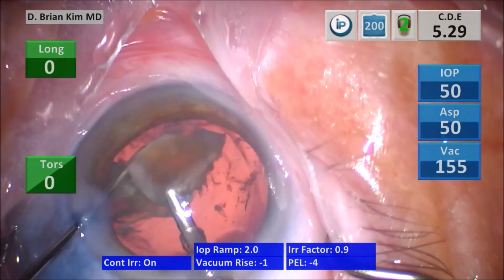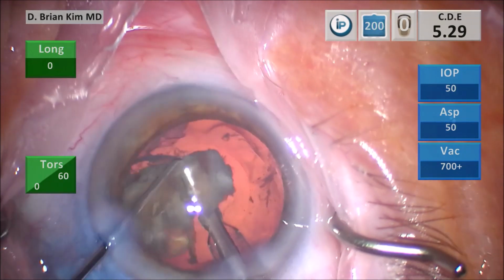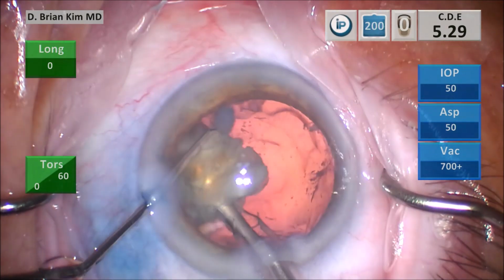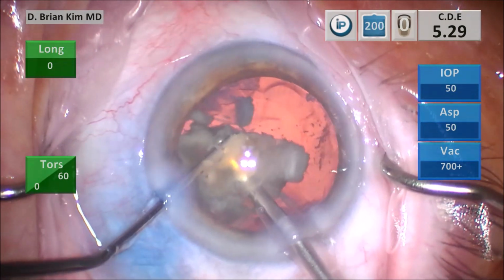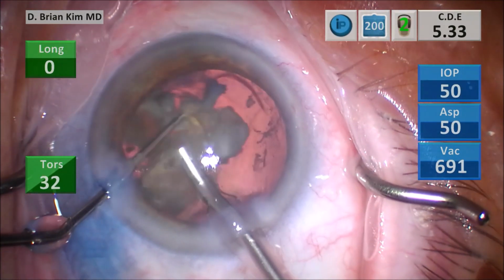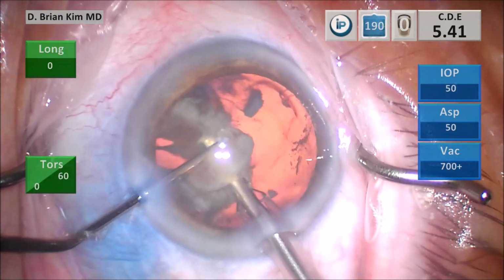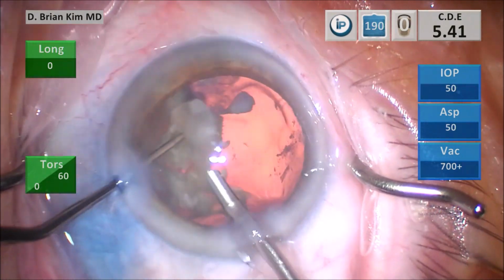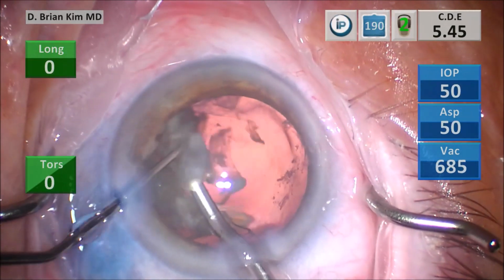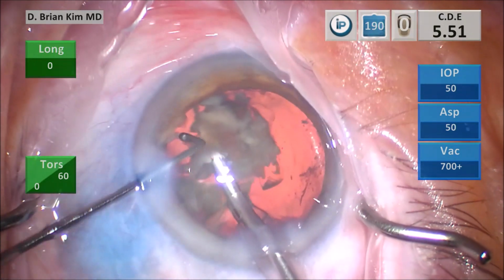And so I'm trying to just position the lens piece between the chopper and the phaco tip and just sandwiching the pieces. Again, I'm doing this under irrigation only. It does create a lot of fragments that seem to be floating around, and it does look a little bit chaotic, but I can assure you this is the best way, in my opinion, to break down these lenses. And again, I'm not using any ultrasonic energy during those maneuvers. I won't ever have to worry about the posterior capsule flying up at me as I'm disassembling the lens, because it's only under irrigation as I do this.